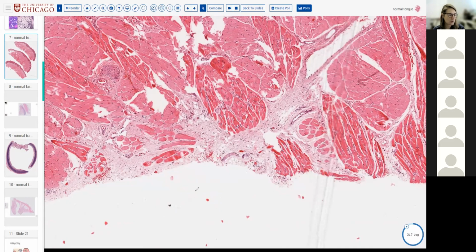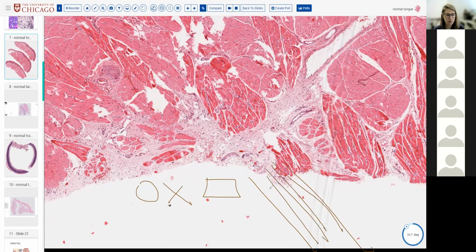Yeah, so the intrinsic tongue muscles, right, are 3 directional. The extrinsic tongue muscles are unidirectional. So this is only really important for knowing where you are, for example, for cancer staging. So there are different oral cancer stages where you upstage if you're in an extrinsic tongue muscle.